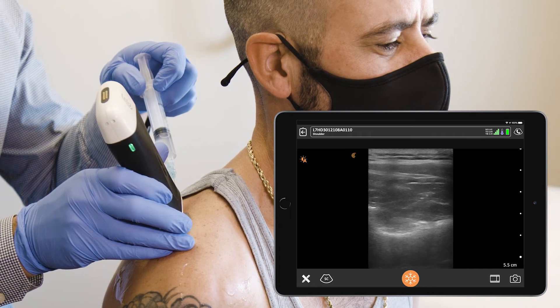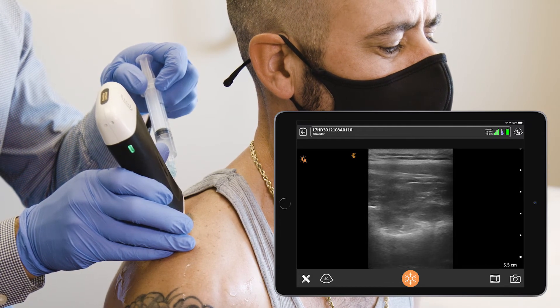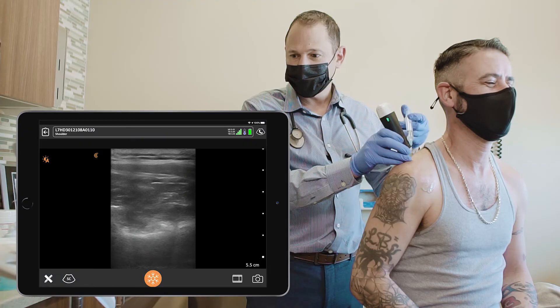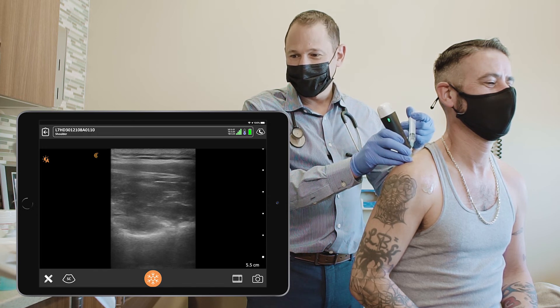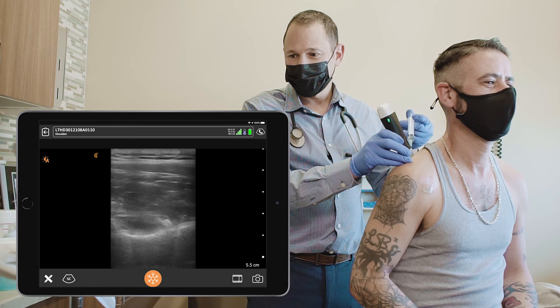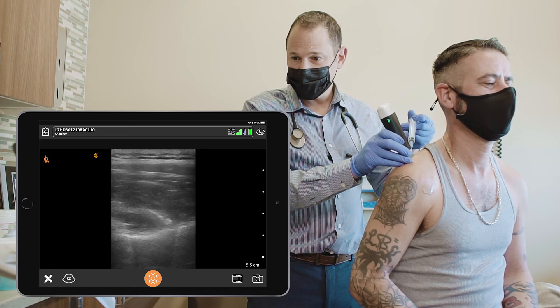Here we go — you can see the needle tip above the nerve and blood vessel. You can breathe, don't hold your breath. You're doing great. I'm trying not to move. All done.